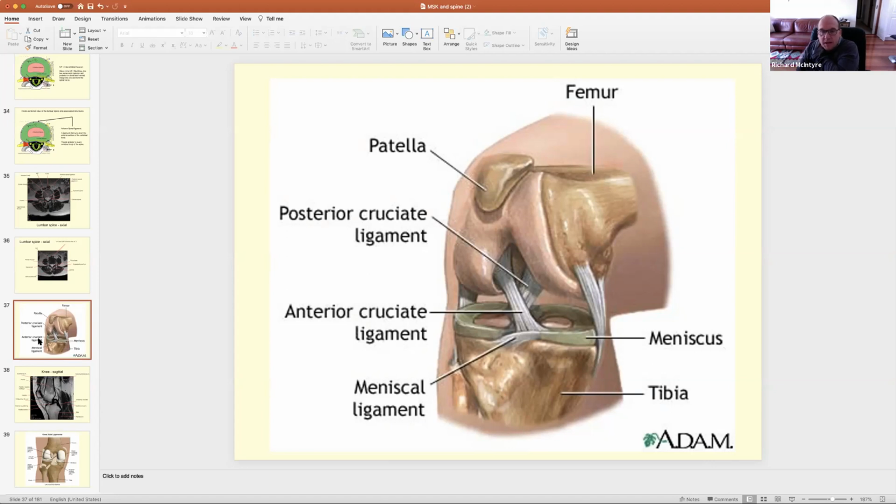We're going to talk about the structures of the knee. To remind you, there are the structures there, mainly the ligaments, the cartilage, and the meniscus. MRI is a valuable tool to offer, in so much as it demonstrates mechanical damage.